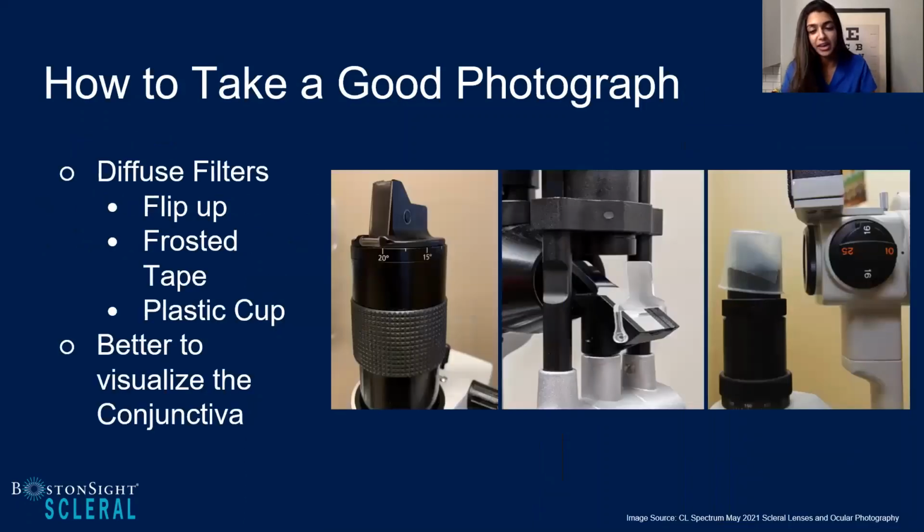I think this is a perfect segue to go into diffuse illumination. I really utilize diffuse light when I'm looking at the conjunctiva and seeing what the scleral lens is doing. And so really, I think the one take-home point is learn your slit lamp. Depending on what model of the slit lamp you have, you might already have a filter that's already put up in there. So these are two images of my Haag versus Zeiss, where I have filters that simply flip up and flip down. There's also the unique trick of taking plastic tape and just taping it over your slit lamp light source to create that diffuse beam.